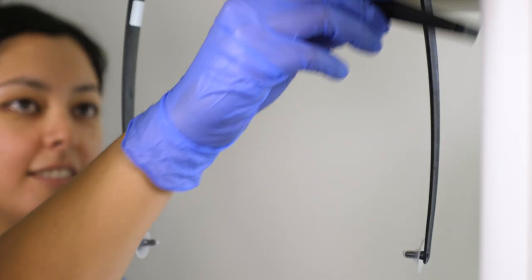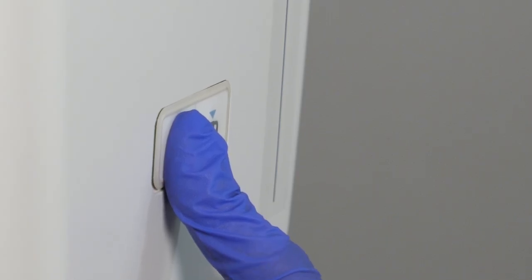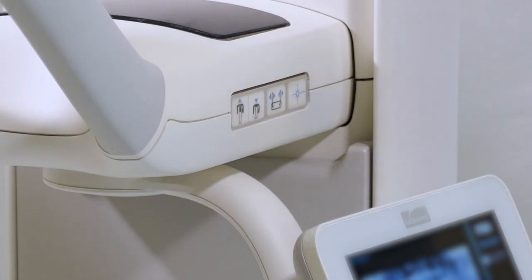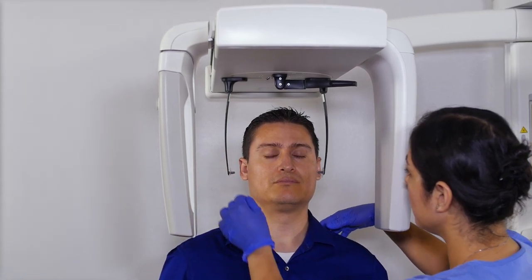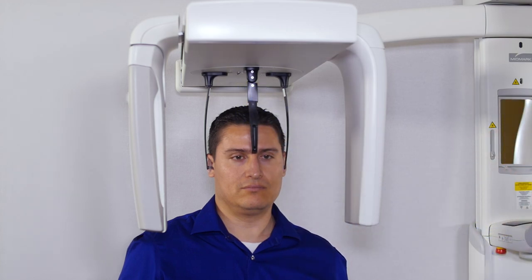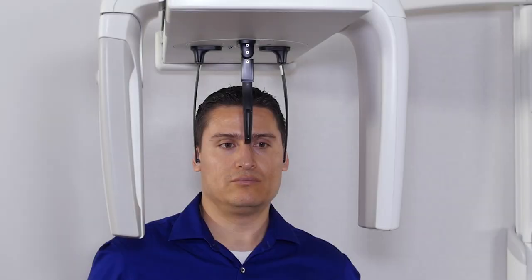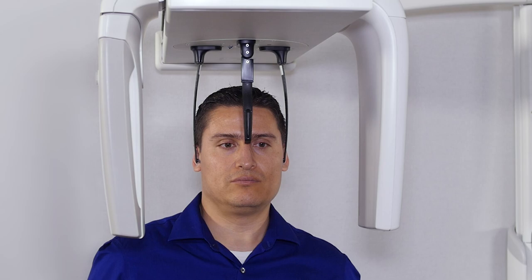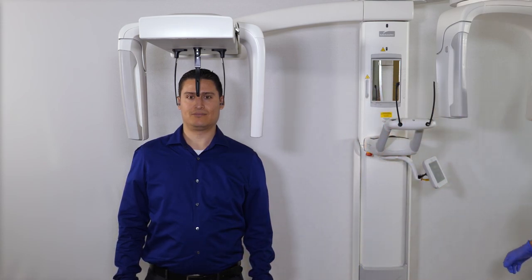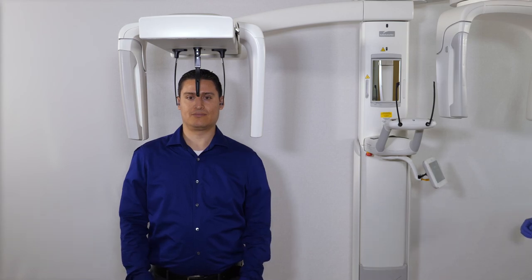Next, rotate the nasion marker up and help the patient to enter the ceph. Using the up-down control buttons on the secondary collimator or on the side of the patient positioning table, adjust the height of the Vantage system until the ear posts are approximately level with the patient's otic canal. Grasp the nasion and slide it vertically until it aligns with the bridge of the patient's nose, then slide it toward the patient's nose until the tip contacts the bridge. For projections where the nasion is not needed, it will rotate about the base out of the projection area.